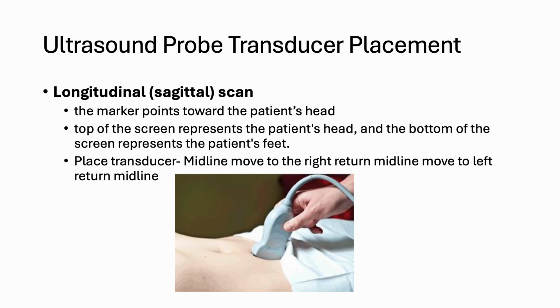So now let's talk about the longitudinal scan, or we also call it the sagittal scan. The marker, so you might see in the image the little divot on the ultrasound probe, is going to point towards the patient's head. And so the top of the screen will represent the patient's head, and the bottom of the screen will represent the patient's feet. So top to bottom. So the midline, the recommendation is to start in midline, move to the right, and then move to the left to make sure you capture the entire area.